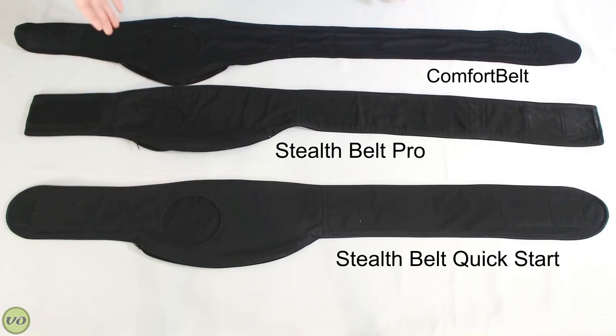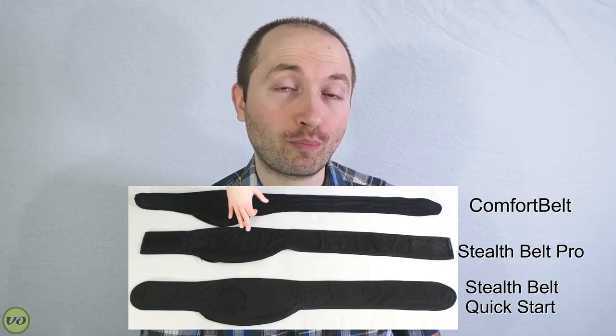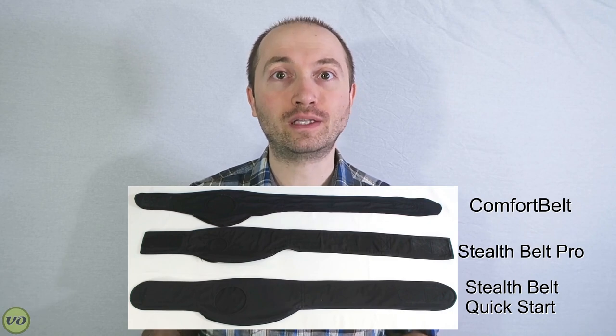Now to start, you're going to notice all three belts are exactly the same as far as how they look with a few very subtle differences. The one on the top is the Comfort Belt. The one in the middle is the Custom Size Stealth Belt Pro. And the one on the bottom is the Quick Start Belt by Stealth Belt — it's for people who aren't sure whether they'll go with the Stealth Belt Pro, as a nice way to get introduced to wearing your bag sideways. I'm going to give a rundown based on different categories that I would imagine people find important.